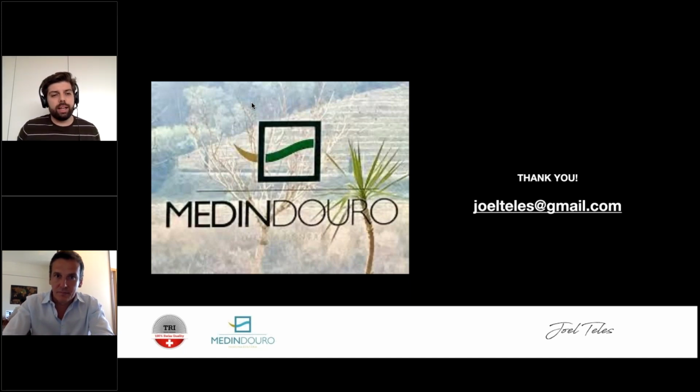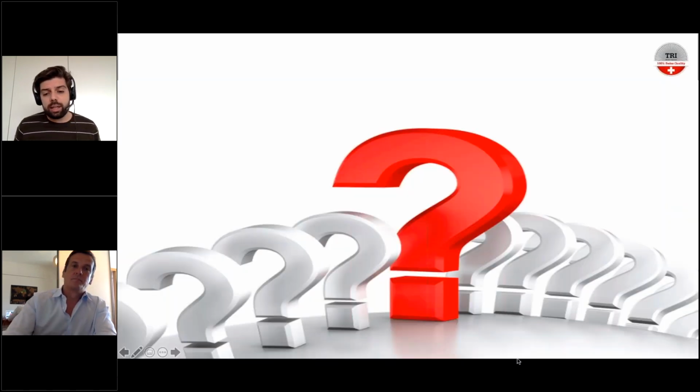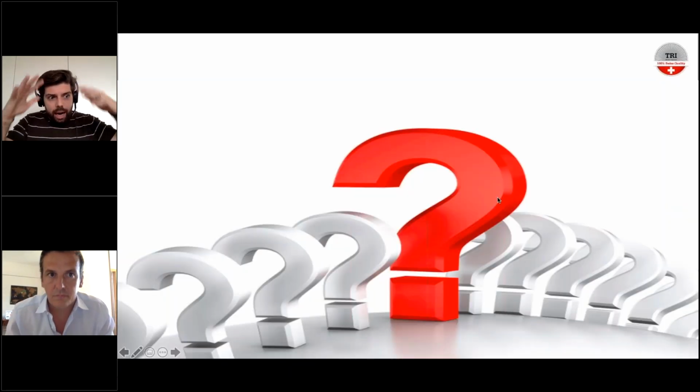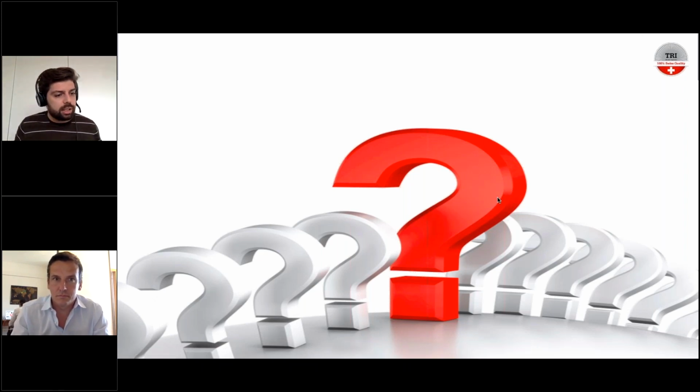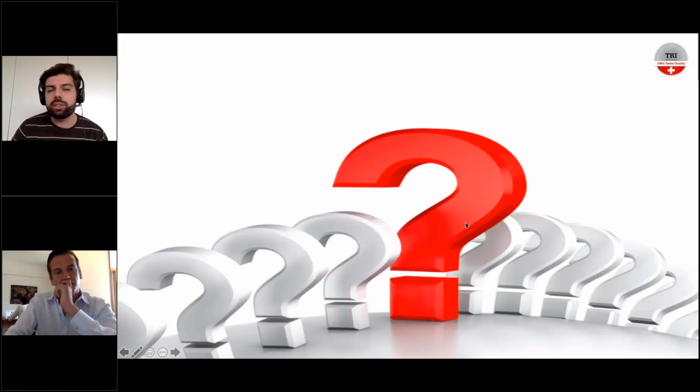I tried hybrid implants with the machined part on the top and the rest not. I have not a clear idea if they work better or not, because my concern is that the part that is actually touching bone may be less efficient. So I don't have an answer for that. I've tried it, but honestly, I'm not sure. In a discussion, it makes sense, but I don't have sufficient material to tell you more.